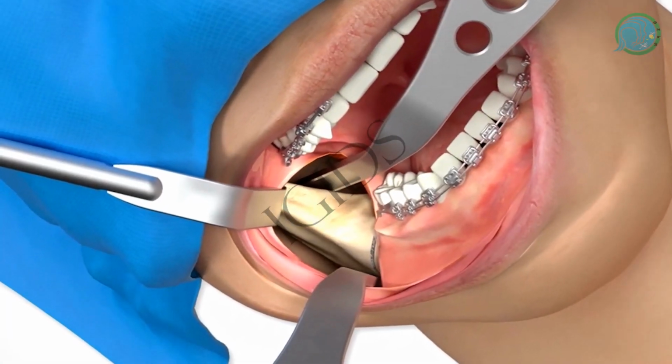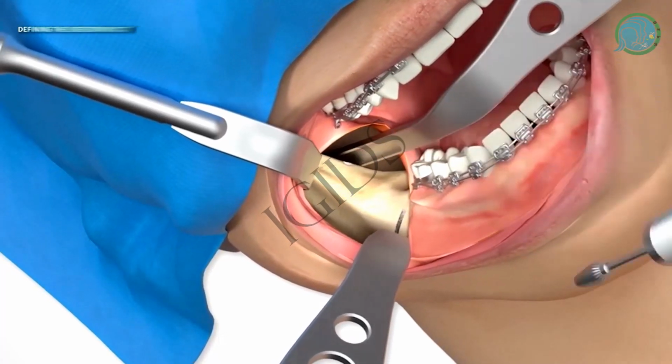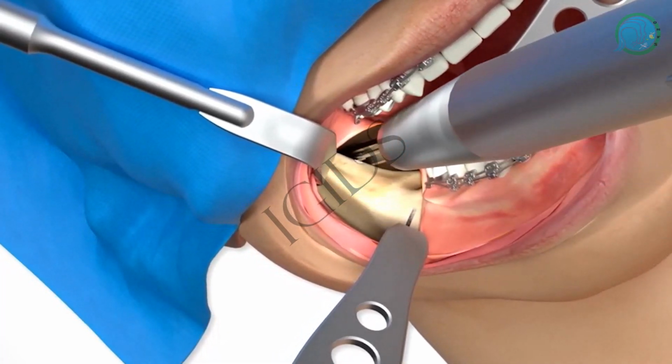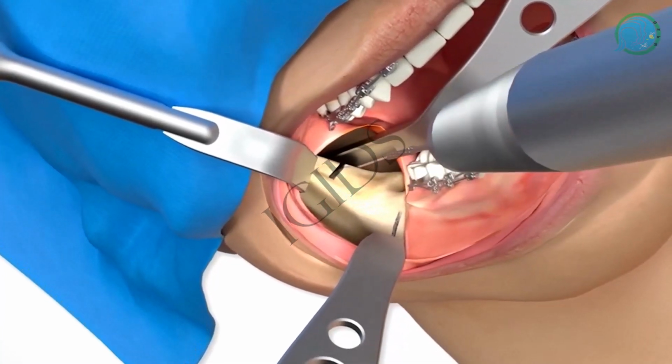Then we place a channel retractor that fits under the inferior border of the mandible. The osteotomy line between the cut at the medial ascending ramus and the vertical cut is connected. Lingual split is placed using a micromotor.